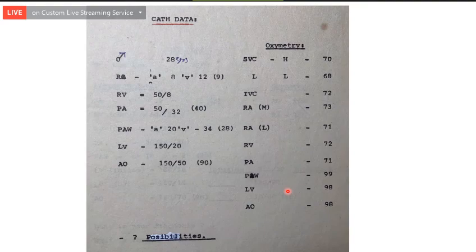Okay, right. Yes. And sir, over the left atrium, we can see both A and V waves are more prominent. So is there a gradient between LA and LV, sir? Why did you say that? No, sir. Sorry, sir, it is 20/20. Sir, V is more prominent. It is 34, sir. Sir, there is mitral regurgitation. Okay, very good. Sir, there is tricuspid regurgitation with moderate pulmonary hypertension, sir.